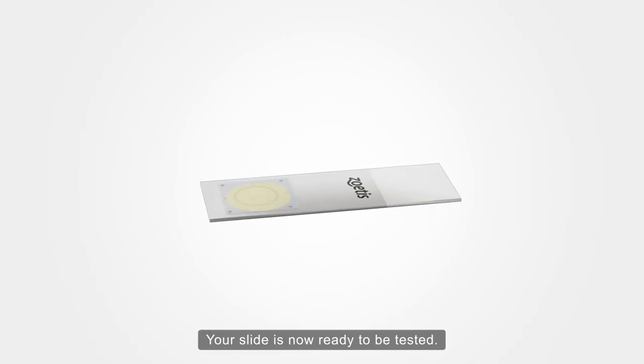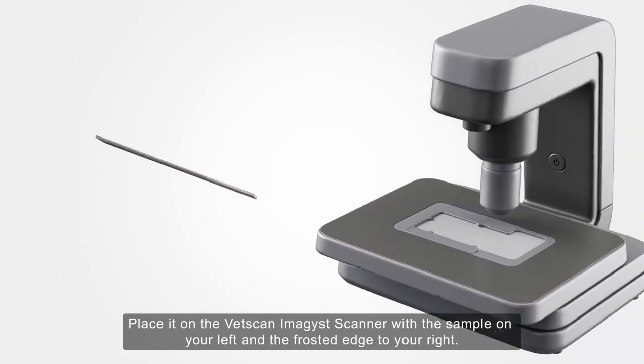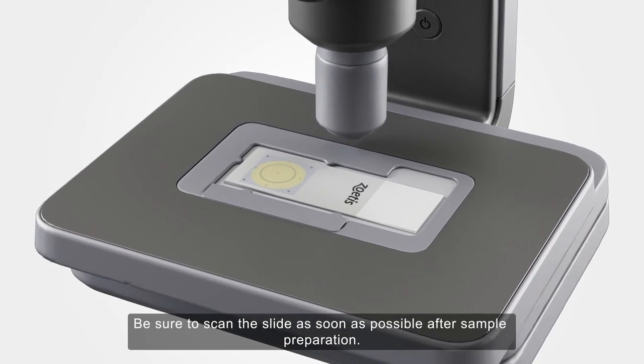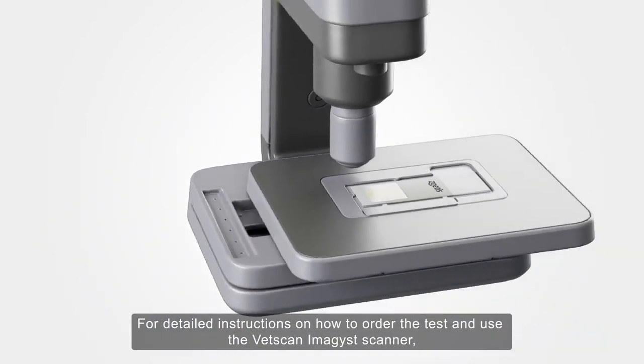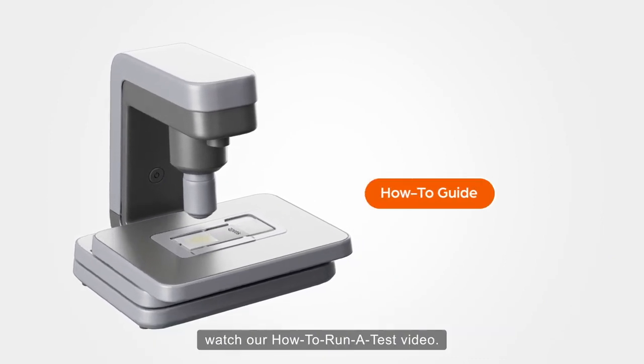Your slide is now ready to be tested. Place it on the VetScan Imagist Scanner with the sample on your left and the frosted edge to your right. Be sure to scan the slide as soon as possible after sample preparation. For detailed instructions on how to order the test and use the VetScan Imagist Scanner, watch our How to Run a Test video.